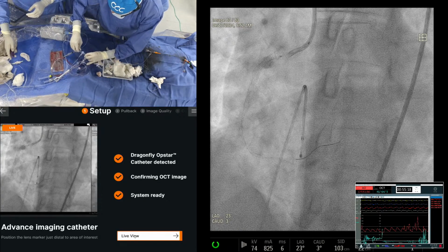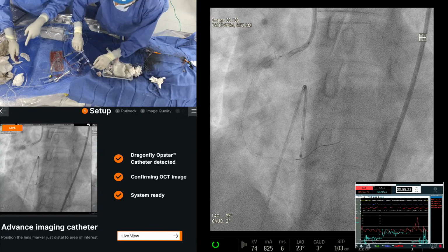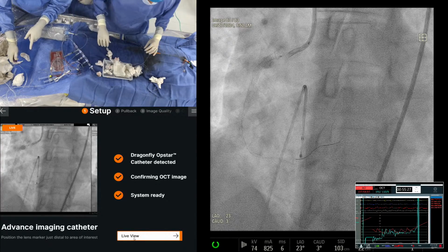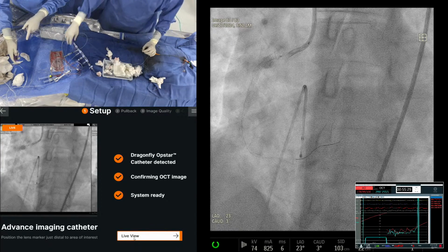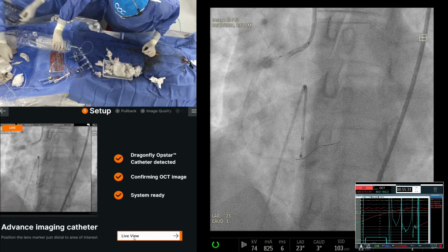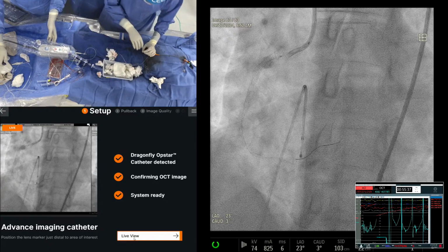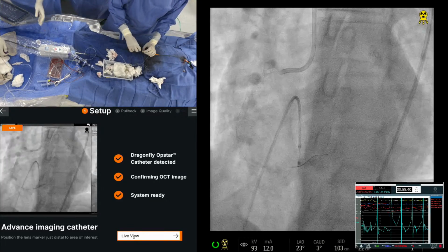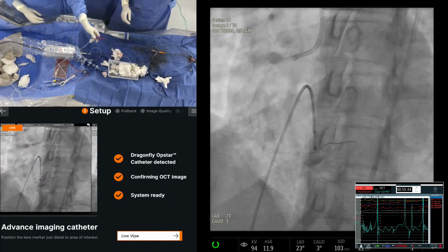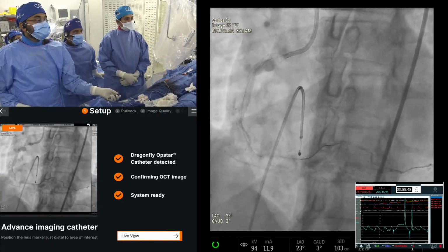Samin, a few people now want you to address the decision about the distal vessel. Let's put in the chat what they would do, then we will say what we would recommend. But we have not seen the distal picture yet because we are doing more vasodilation in the epicardial picture. You saw that in the last view, and they were watching and making the observation.